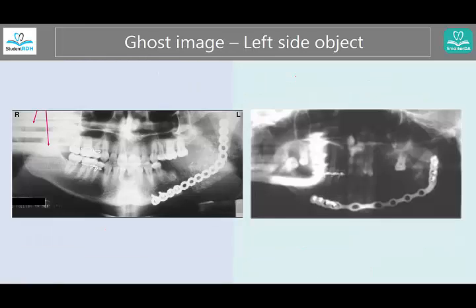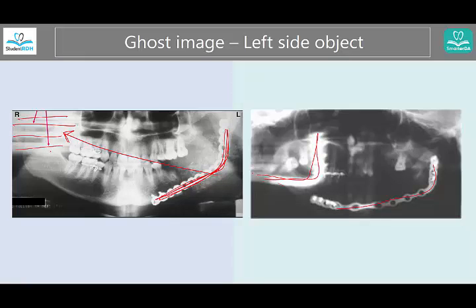Here you can see a bar that's in the patient's jaw, probably implanted due to trauma. Do you see those lines? Those are the ghost images. Notice all three characteristics: higher up, on the opposite side, and blurry. This next example is very similar but the ghost image looks a little different.